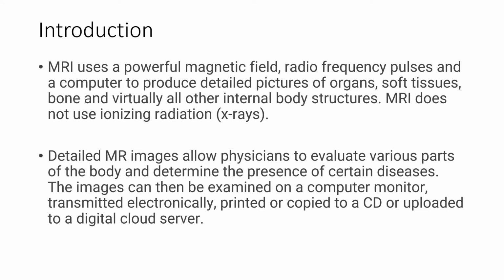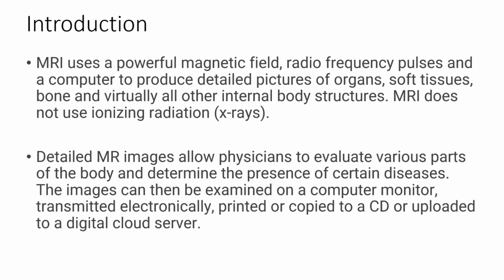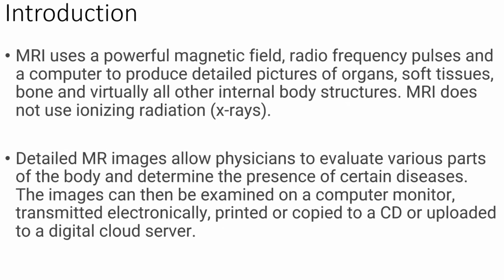With the details of the images, the radiologists or physicians are able to evaluate various parts of the body and determine the presence of certain diseases, according to what type of examination. The images will be in the form of sagittal, coronal and axial planes. So we can produce 3D images altogether. Alright, so we take a look at a video.